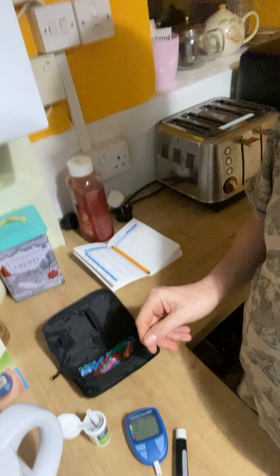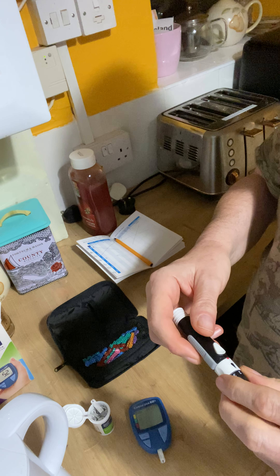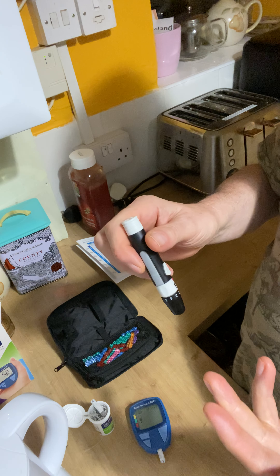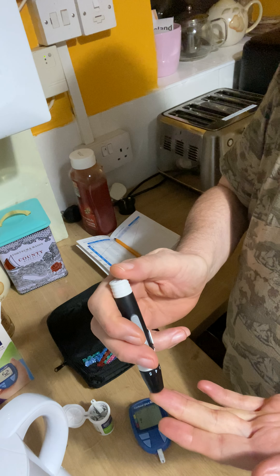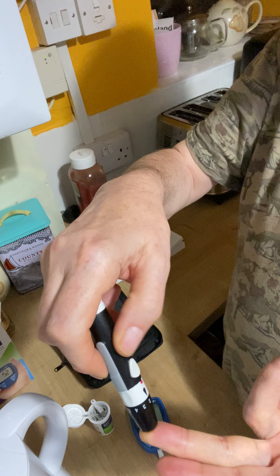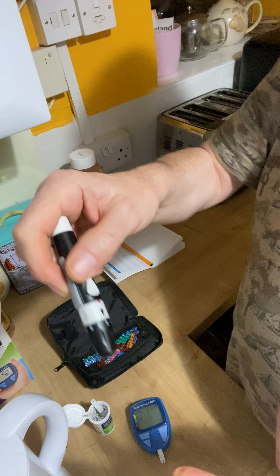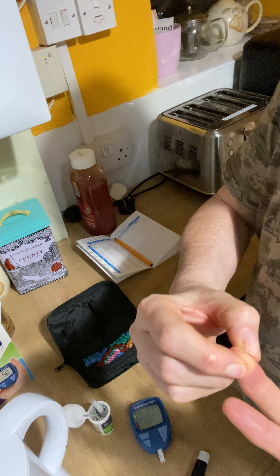Leave that down there. Pick a finger, right side, and press this button.